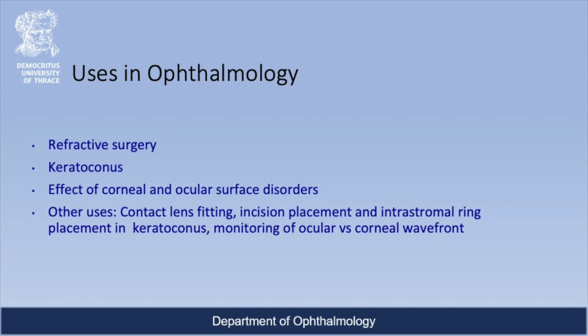planning and follow-up of presbyopic photorefractive keratectomy, the so-called presbyPRK, and presbyopic laser in situ keratomileusis, or otherwise presbyLASIK. Finally, Placido disc topographers can be used for the examination of post-surgery astigmatism. For example, post-cataract surgery and post-keratoplasty corneal astigmatism can be studied with the topographer, and selective suture removal or other interventions can be planned.